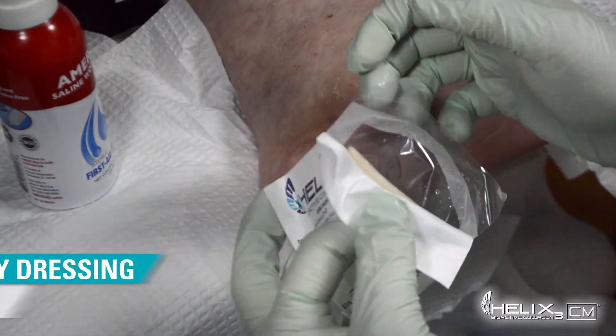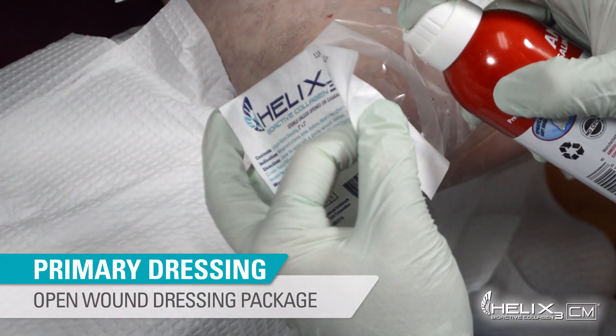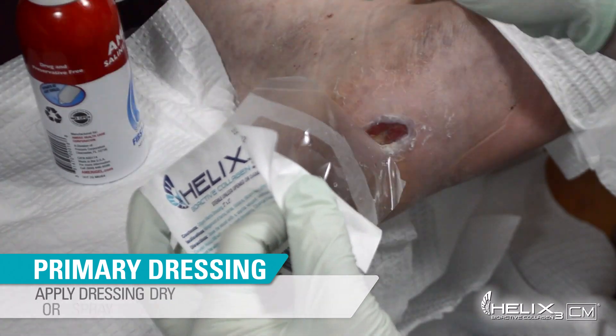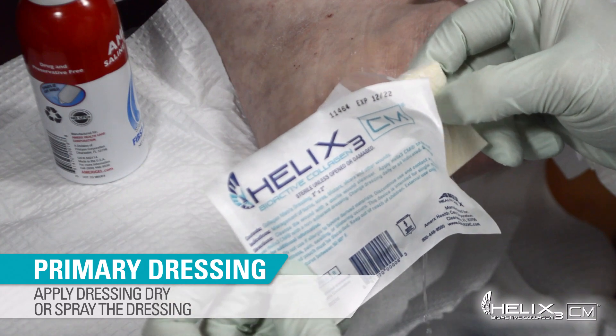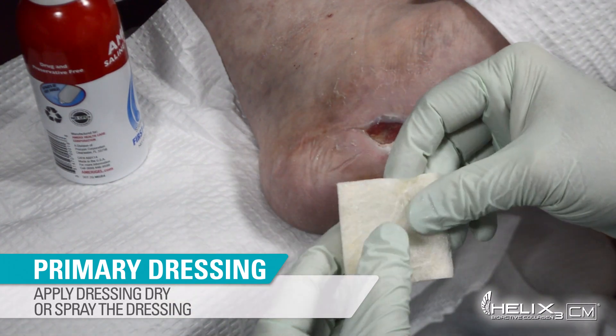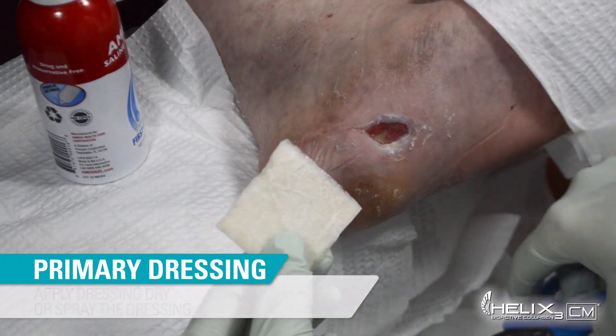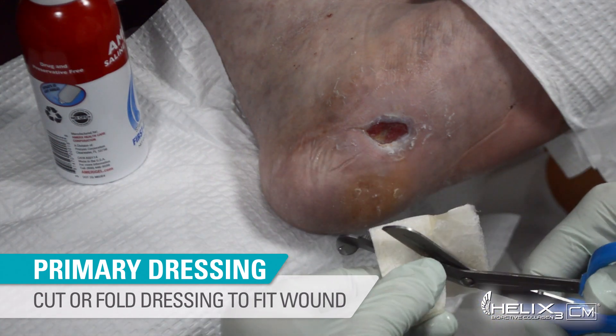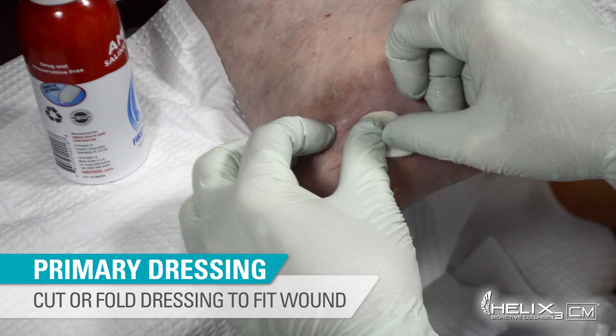Following wound cleansing, open the pouch containing the Helix 3 CM Collagen Matrix and apply the dressing dry, or moisten the dressing with the Saline Wound Wash. Next, cut the dressing to fit the wound size, or fold any overlapping product to fit within the wound border.